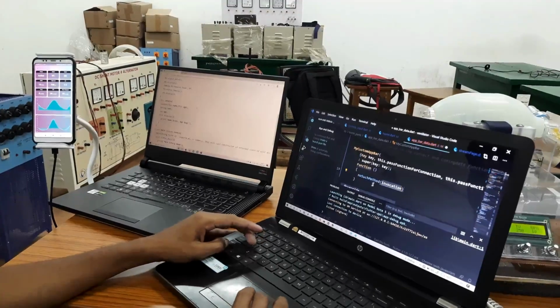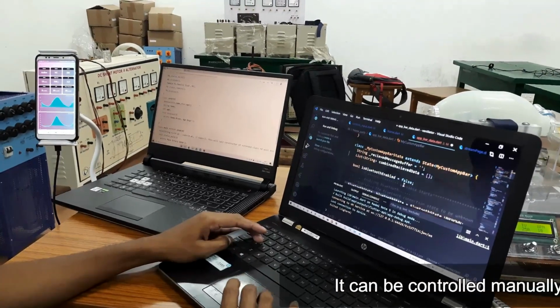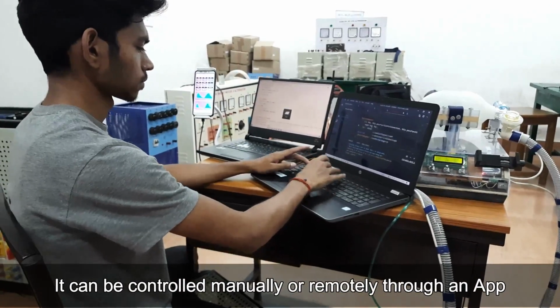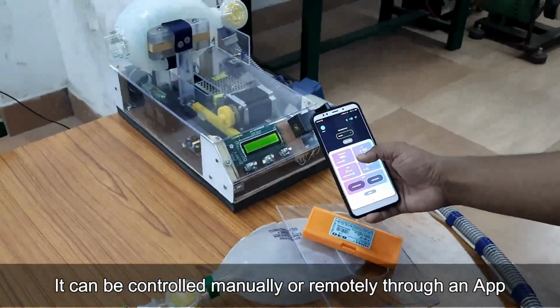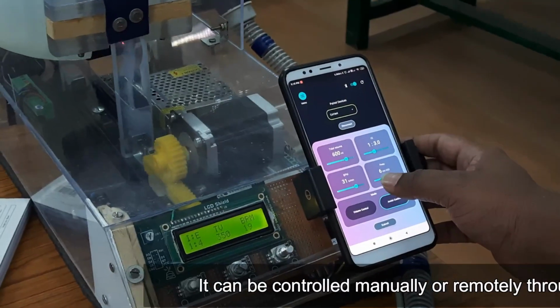The main objective behind the development of an app is to keep the medical staff and the doctors safe by remotely controlling the ventilatory parameters outside the ICU and also by monitoring these parameters and the waveform through the app, which makes the design novel as there is no contact between the patient and the doctors.